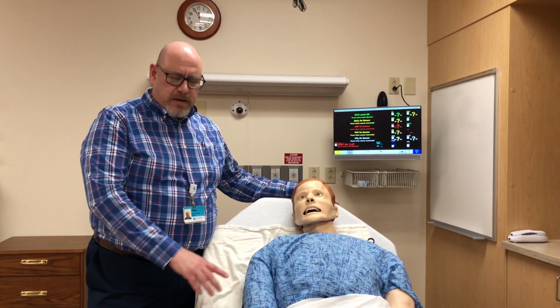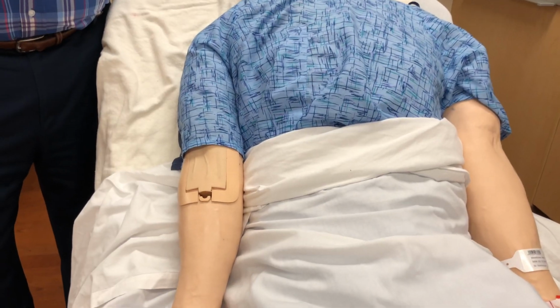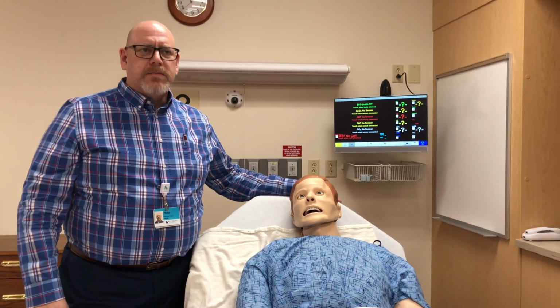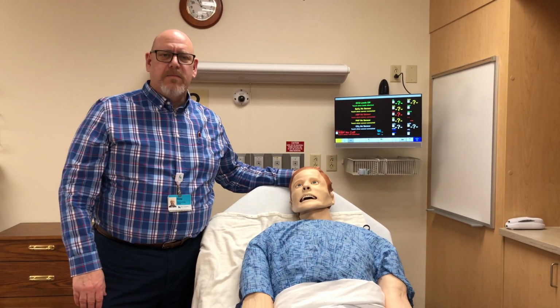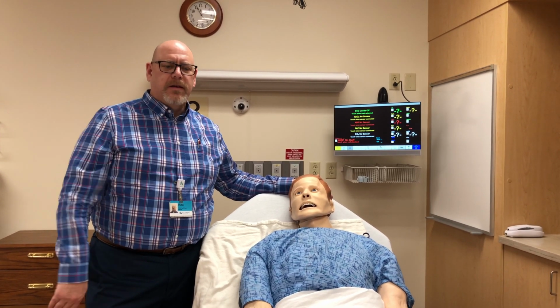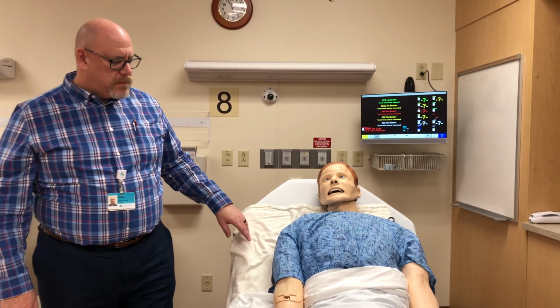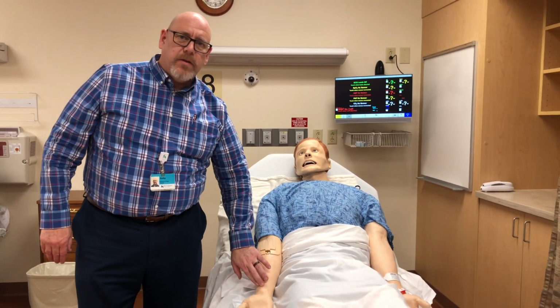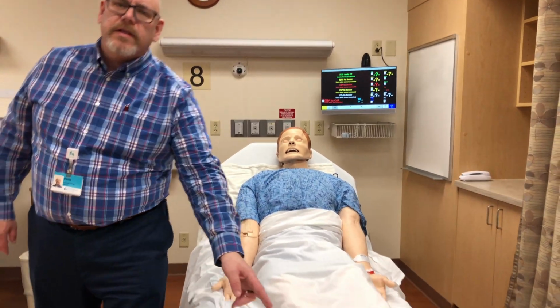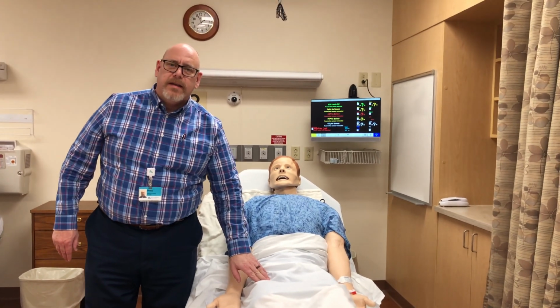You can start IVs on this mannequin. You can listen to chest sounds, heart tones, bowel sounds. This mannequin has sounds in the front and the back, which a lot of the older mannequins only have in the front. This mannequin has pulses in the radial pulses, carotid pulses, pedal pulses in the feet. You can check a femoral pulse on this mannequin.